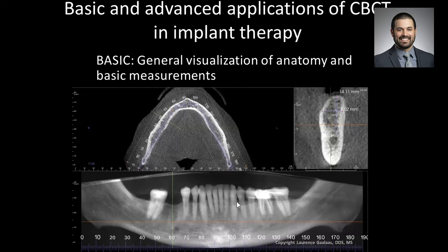Okay, you don't need a lot of image detail to go this route. In other words, a higher level of noise, like in this scan, is acceptable because you can start to see exactly where the bone is and the canal is, you're fine. What this scan does functionally for you is it gives you basic measurements, but it's really information going to your brain to help you mentally decide what implant size to select and where it's going to go, and then you will freehand place that implant surgically.